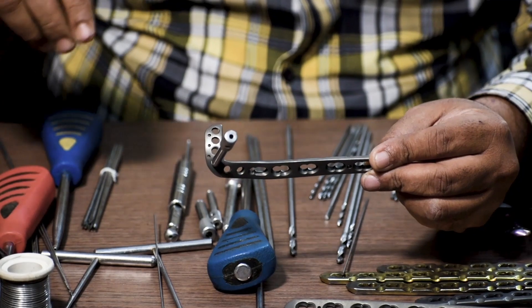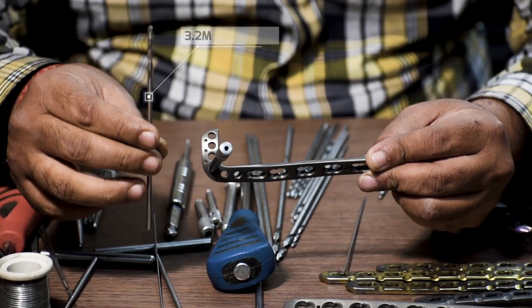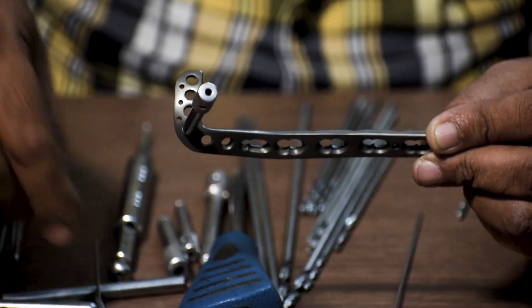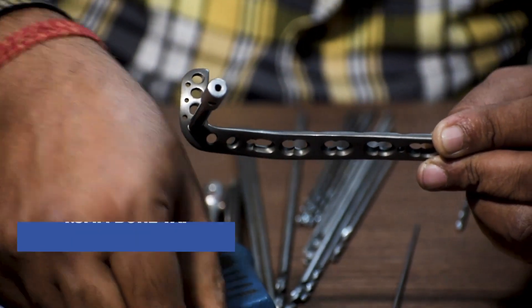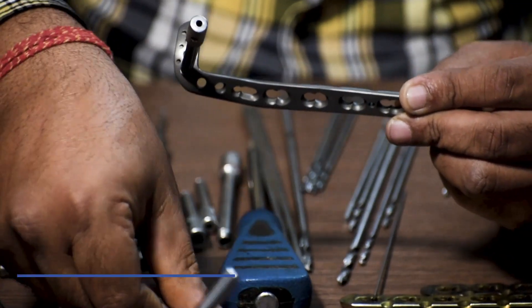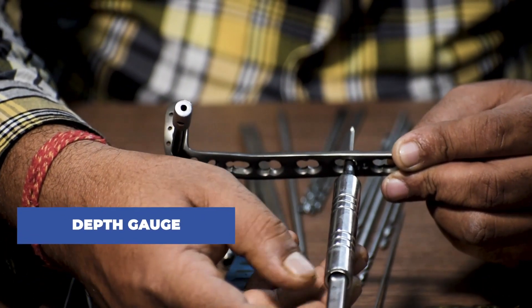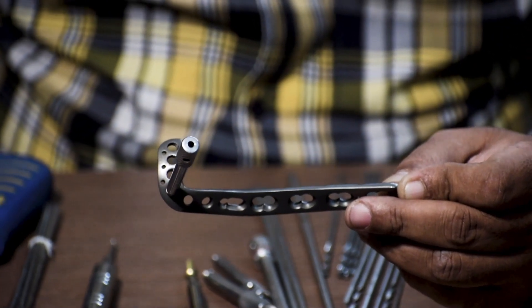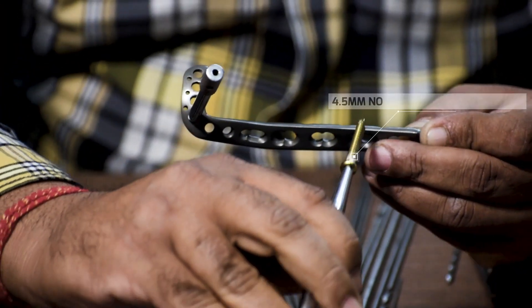First we will be fixing the shaft region of the plate with the bone. To place a non-locking screw in the shaft region, we will use a 3.2 mm drill bit and drill through the non-locking hole. After this we will use a 4.5 mm bone tap to create a smoother entry for the screw. Then we use a depth gauge to measure the length of the screw needed — we are taking 30 mm in consideration. With the help of a 4.5 mm screwdriver, we fix a 4.5 mm non-locking cortical screw in this region.